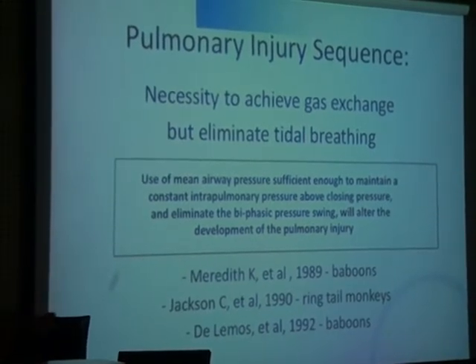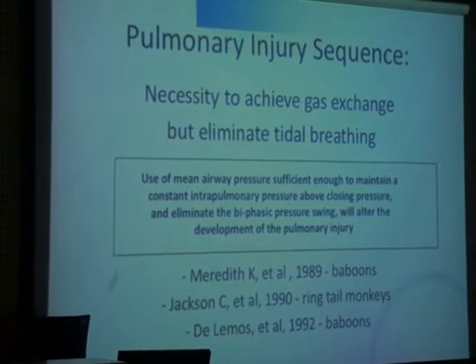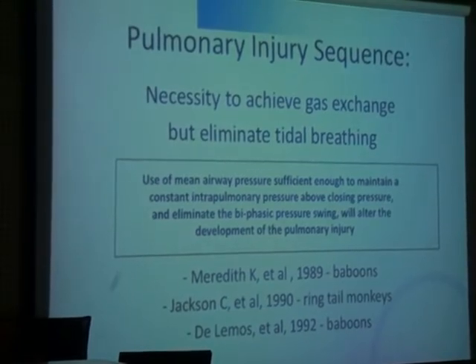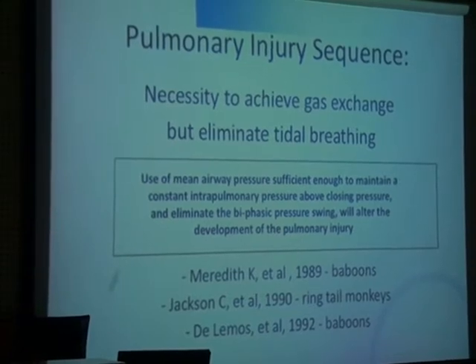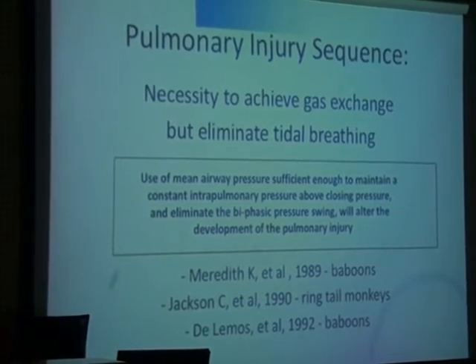And the concept is, how does a panting dog actually ventilate? Because they're panting and they're breathing at dead space. And we know that if you breathe at dead space, you don't ventilate. So if I was to take you and give you a 2 per kilo tidal volume, I could ventilate you at 60 times a minute. It still wouldn't ventilate you very well a lot of times. And so they started exploring, how does a dog do that?